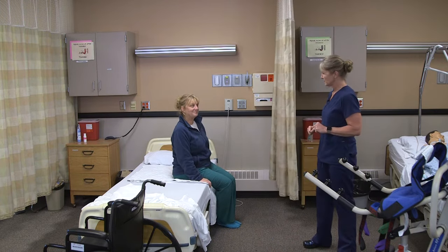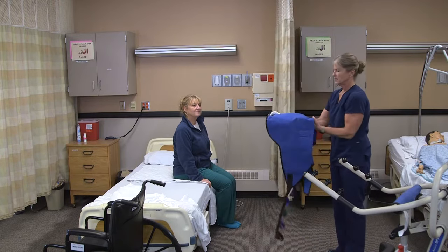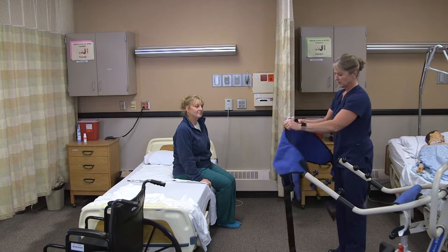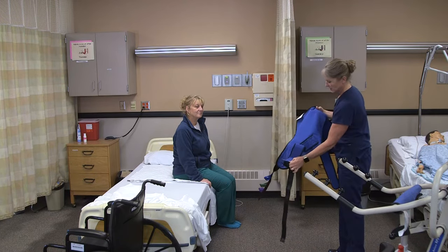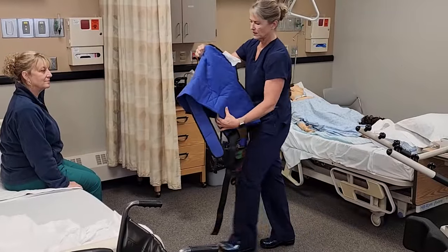Are you ready to go? Are you feeling okay? With the slings, the tags should be out and away from the resident. This particular sit to stand has a seat belt that goes around it, and you can see the kind of cut-outs for the arms.